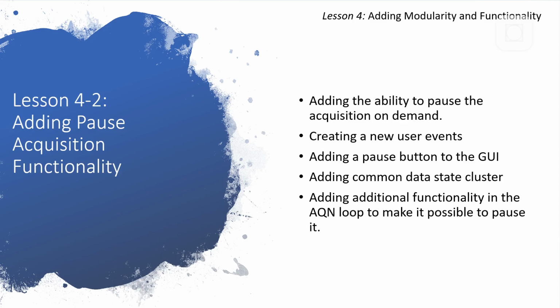We could do this manually by setting a default value, but then we need to update it in 2 places if we want to change that. What we'll do instead is to add a place in the initialization where you set these values, and then both the GUI and the acquisition read that value and know if it should start running or start paused.